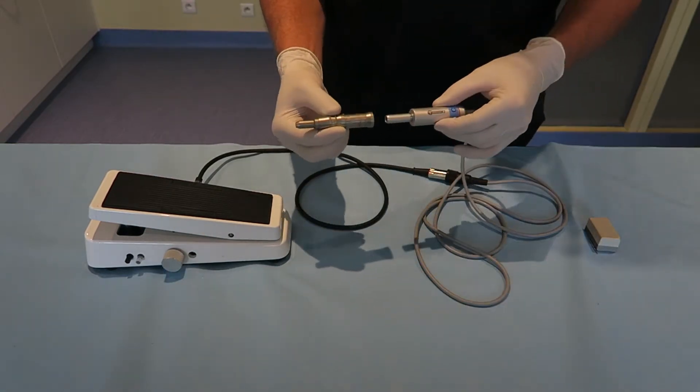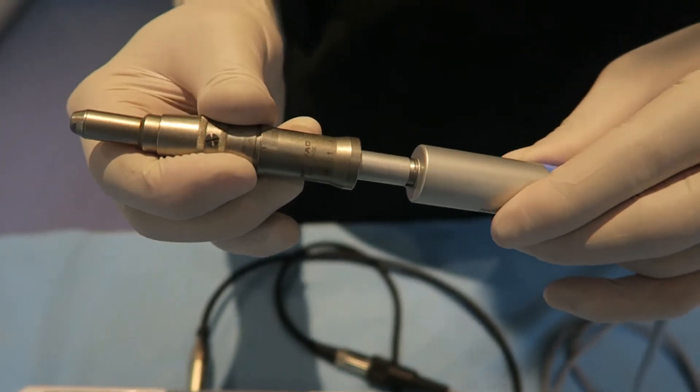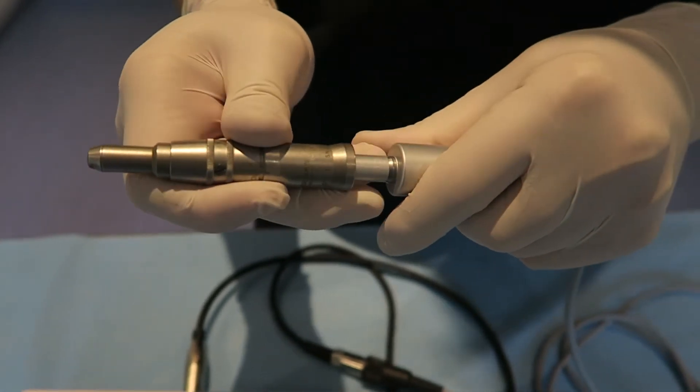The handpiece engages very easily. You just need to place it onto the motor and gently push it all the way down until you feel one click. To remove the handpiece, you need to pull it up.